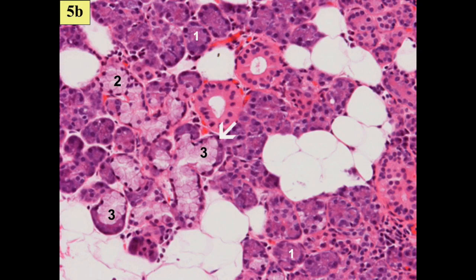In the second slide, B, you can notice the presence of mucoserous acini together with serous. The predominant type is the serous. We have some fat cells in the connective tissue. This is the submandibular gland of human.